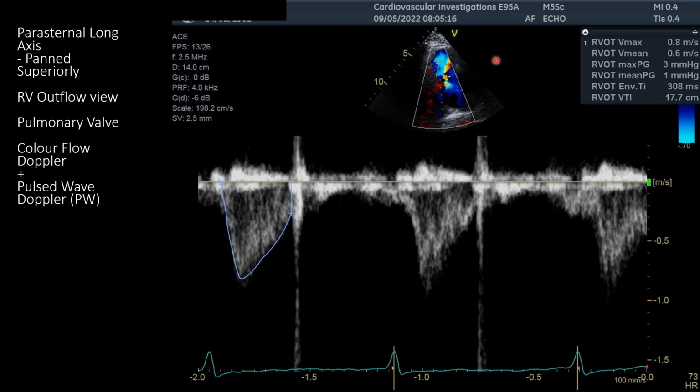And therefore we can be more specific about which velocities we're trying to interrogate along this line of interrogation, as to be those velocities only within the anatomical boundaries of where we set the gate, in this case in the RV outflow tract. Tracing the spectral Doppler allows us to calculate the maximum and mean velocities as well as the pressure gradient in the RV outflow tract based on those velocities that are occurring there.